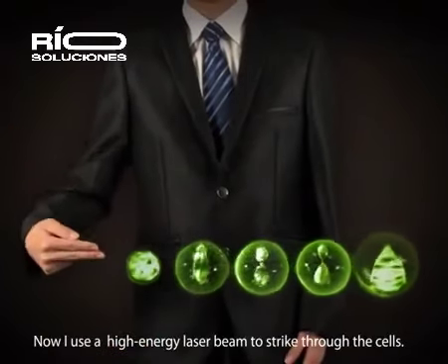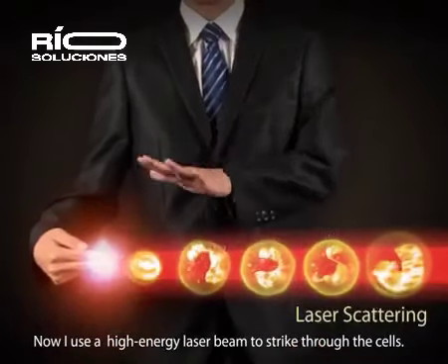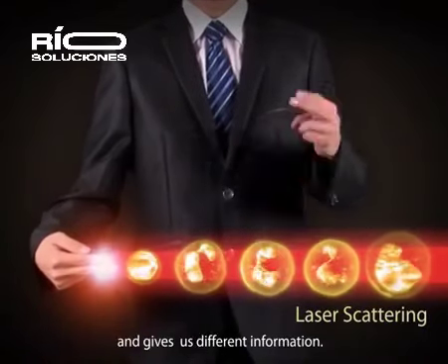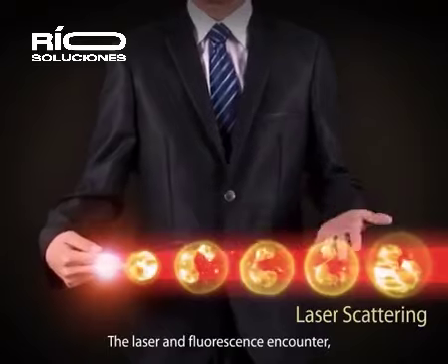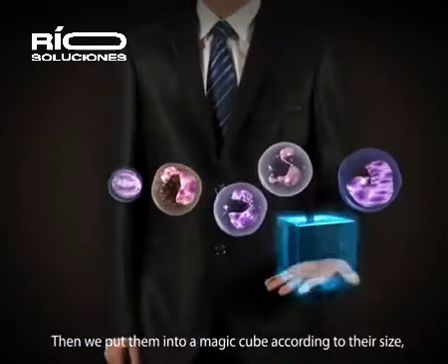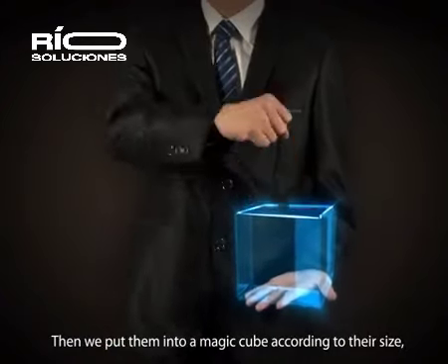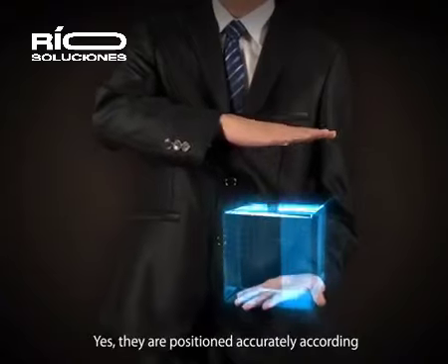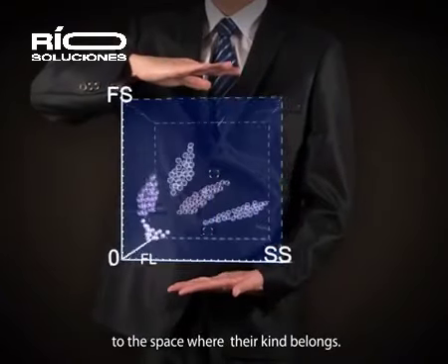Now I use a high-energy laser beam to strike through the cells. The laser beam scatters the cells at different angles and gives us different information. The laser and fluorescence encounter, and all the cells are under examination. Then we put them into a magic cube according to their size, complexity, and fluorescent intensity. Yes, they are positioned accurately according to the space where their kind belongs.